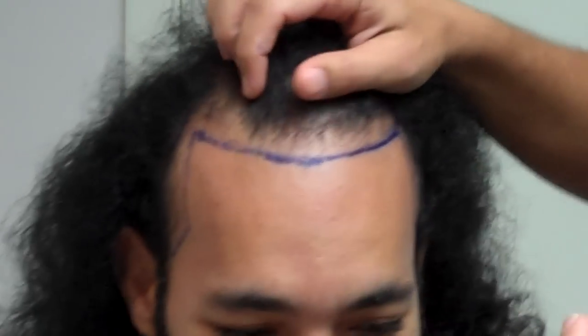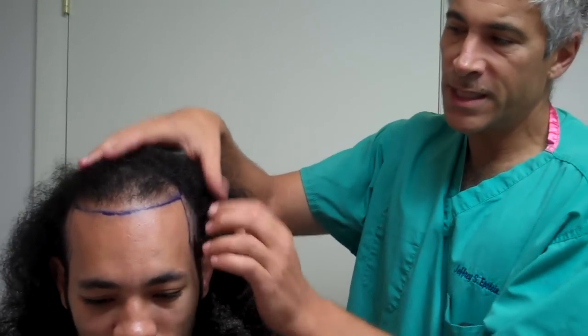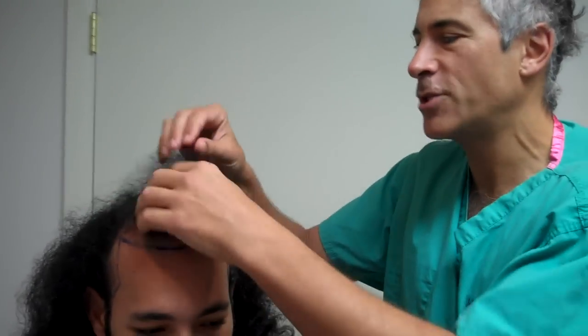What we're going to do for him today — he's a little over 30 — we're going to restore a nice, reasonably conservative but nice-looking hairline all along the sides. Same thing on this side, what I call the Brad Pitt temple areas, but not quite as dramatic.